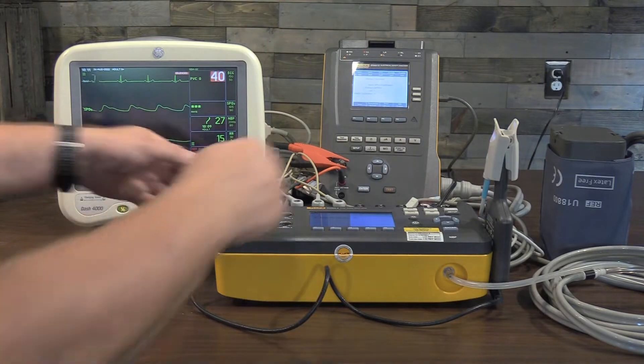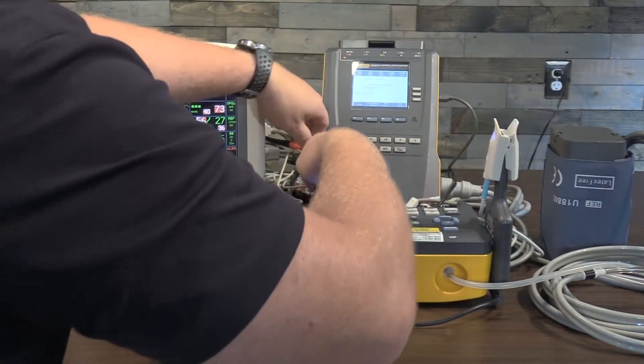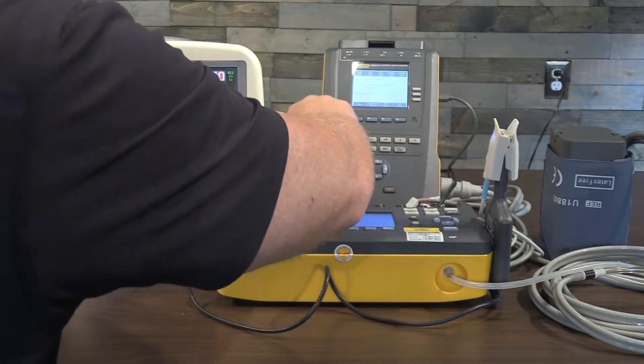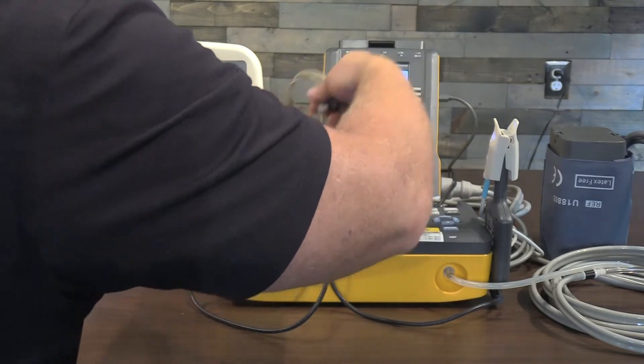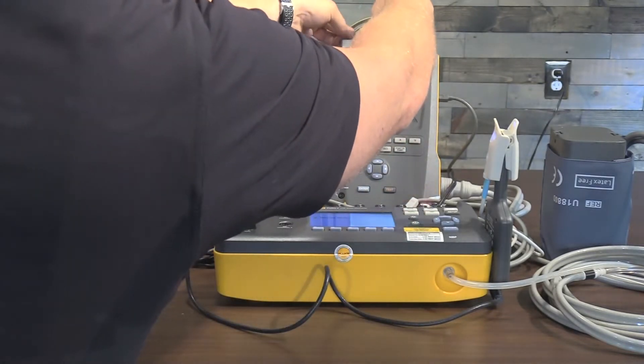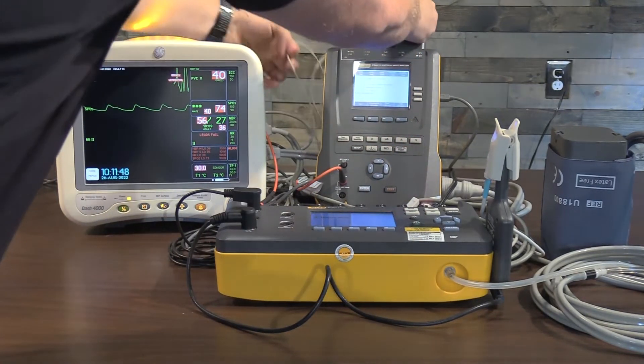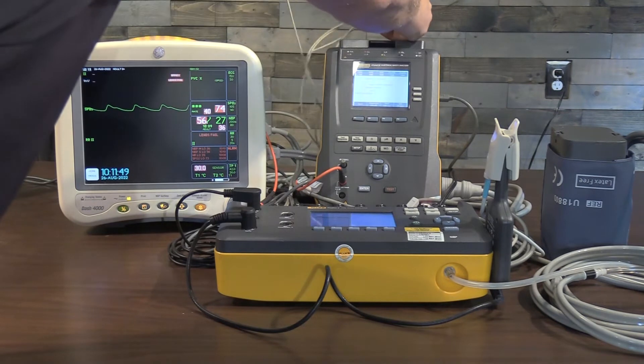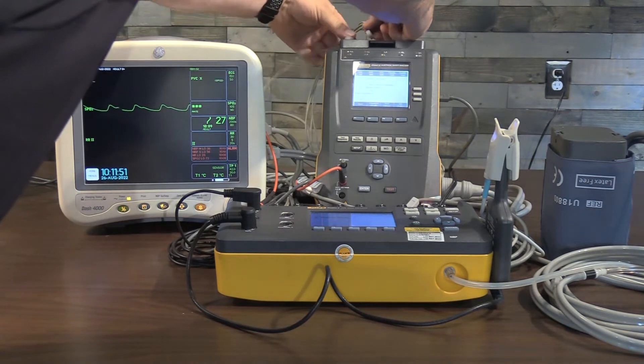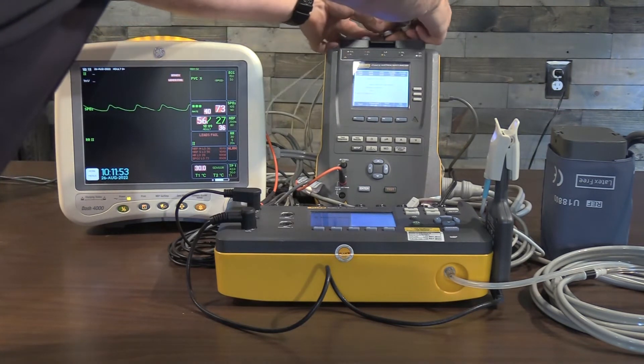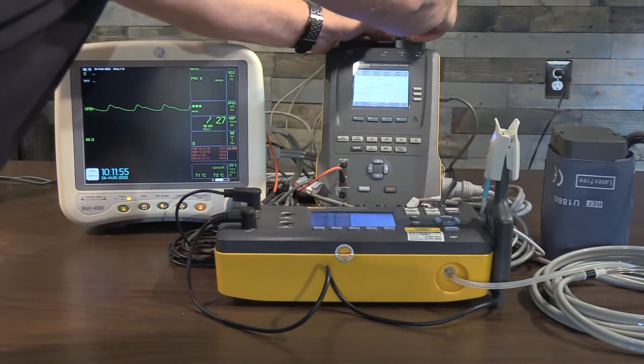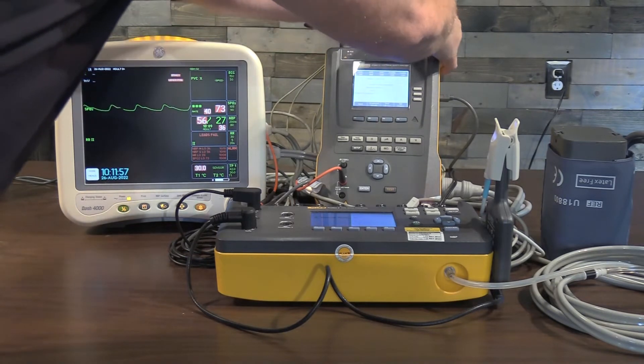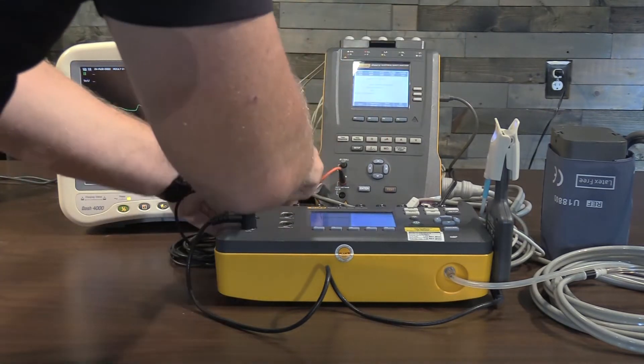Let me go ahead and move my ECG leads up to my safety analyzer.